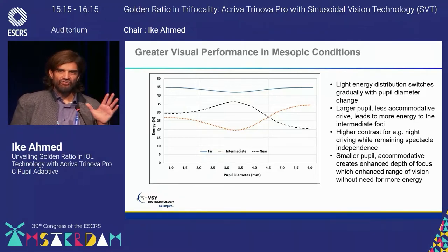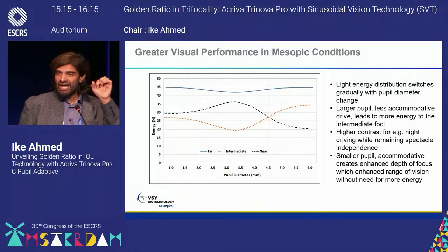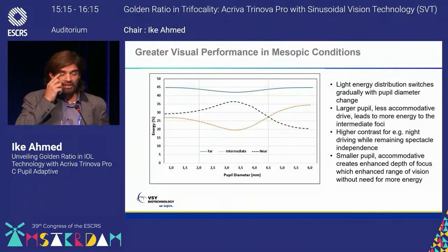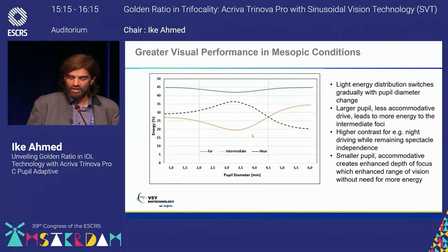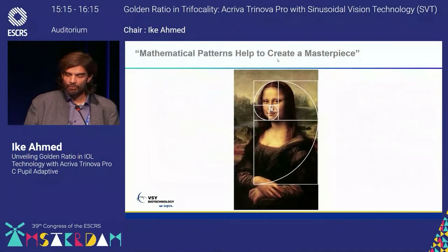Pupil adaptiveness, I think, is very clever. With a small pupil, we have really good depth of focus. We may not need to have as much light distributed, for example, to the intermediate zone. On the other hand, when we have a larger pupil, less accommodative demand, and night vision, we may want to shift light more toward the intermediate foci. And as you see here, we have excellent distribution to distance throughout all different pupil sizes. The dotted line is near; you see an increase in near as you get to the 3 to 4 millimeter pupil, and then it drops down in scotopic conditions while intermediate goes up. This is a very clever way to allow us to distribute light energy with these focus points.